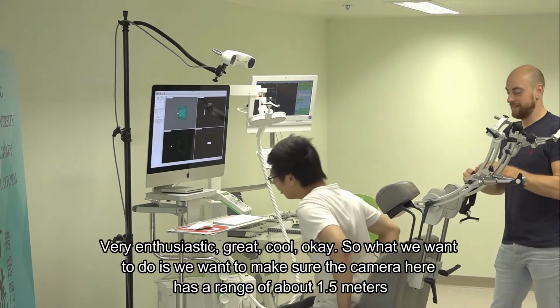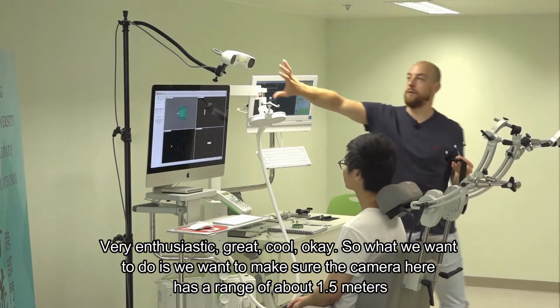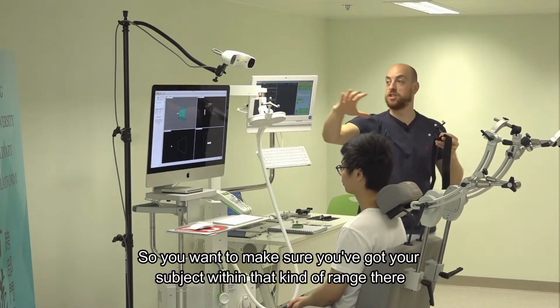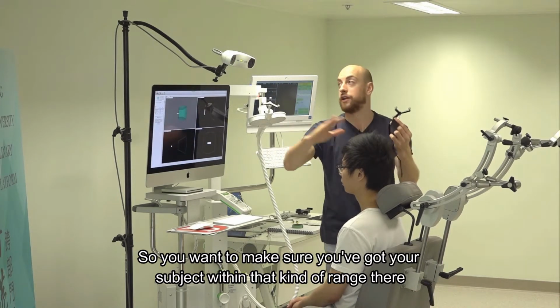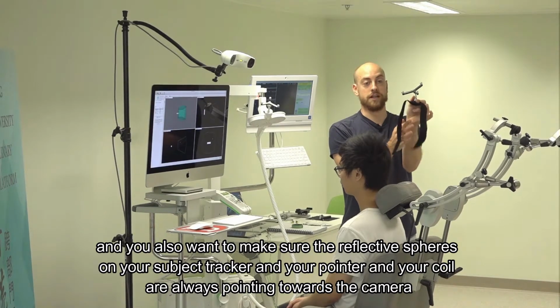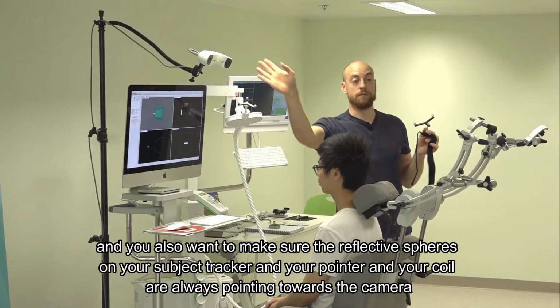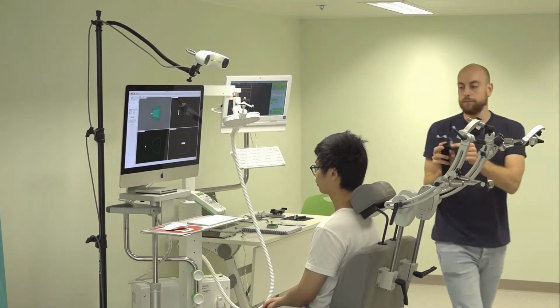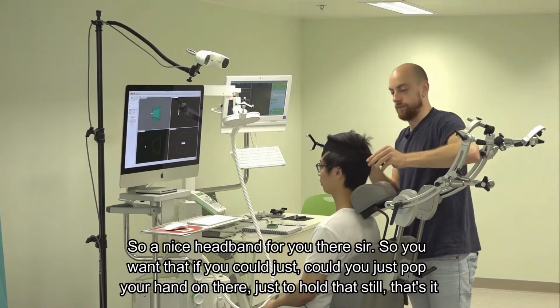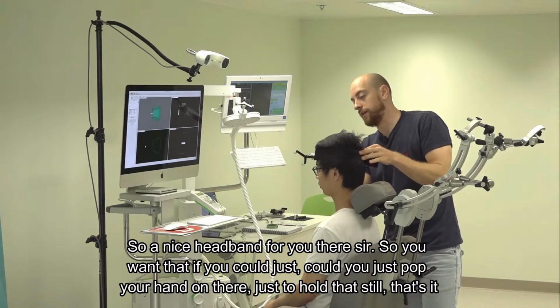What we want to do is make sure that the camera here has a range of about 1.5 meters. So you want to make sure you've got your subject within that kind of range there. You also want to make sure the reflective spheres on your subject tracker, your pointer and your coil are always pointing towards the camera. So a nice headband for you there, sir. There you are.